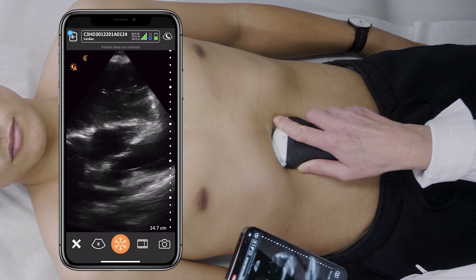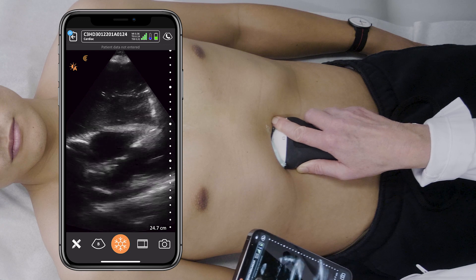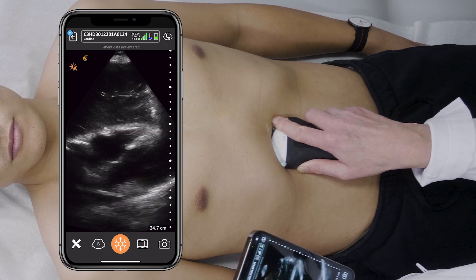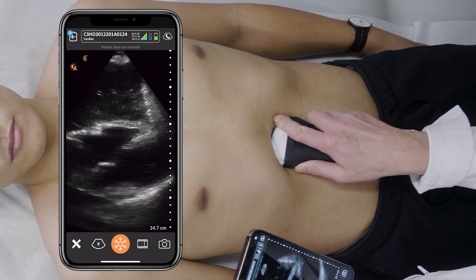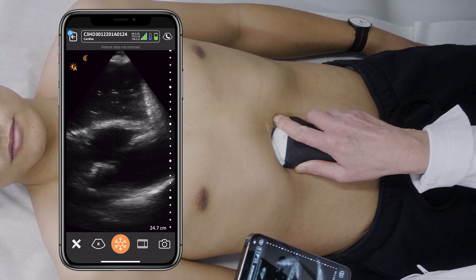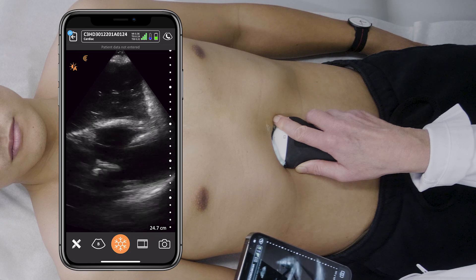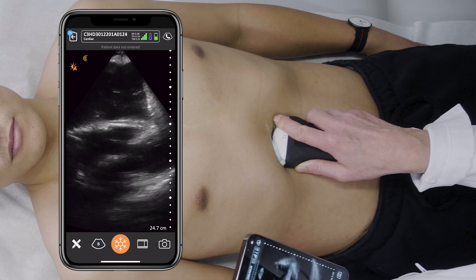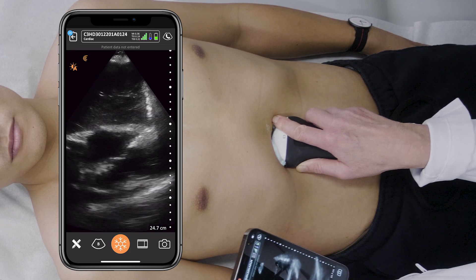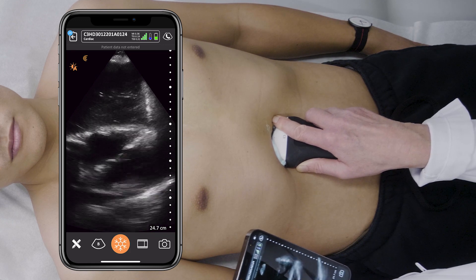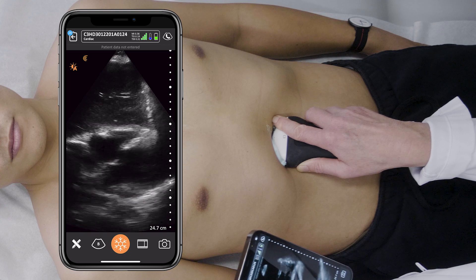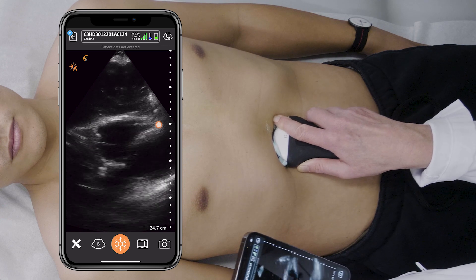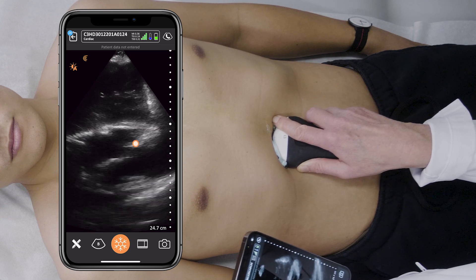I can use this view in trauma to look for a pericardial effusion, but I can also use it to look for left ventricular contractility and any signs of pulmonary embolism where you would see the septum bowing into the left ventricle.